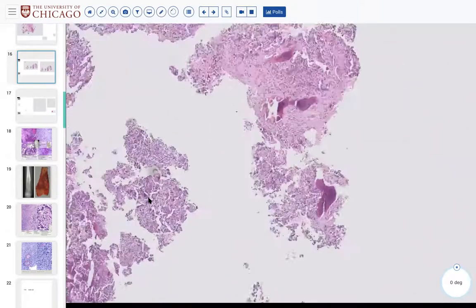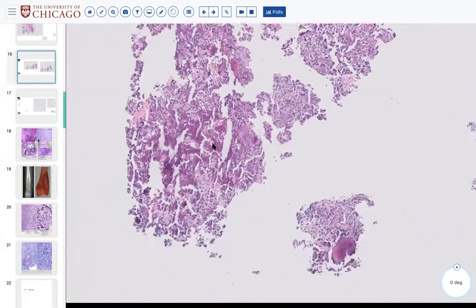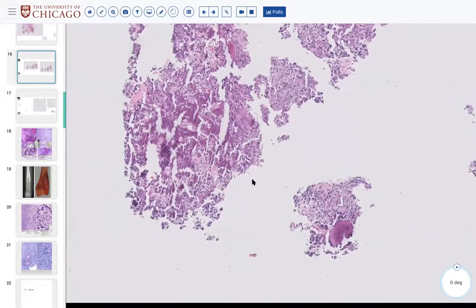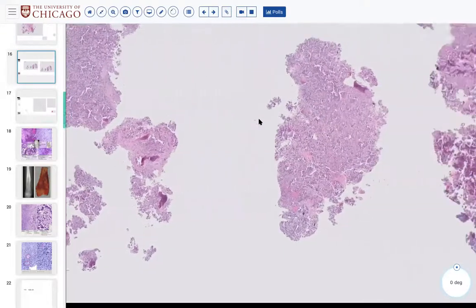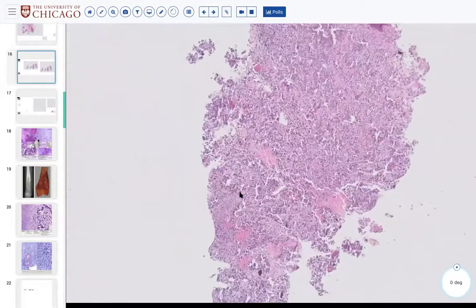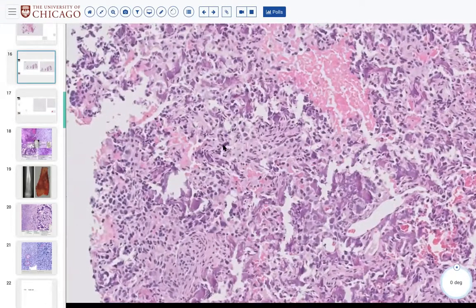And so, you know, when we talk about, you'll always hear me say in thyroid, parathyroid, right? Random endocrine atypia, random endocrine atypia. Well, this is not random endocrine atypia. This is not an endocrine lesion, right? So when you see, in a mesenchymal lesion, this random popping out atypia, actually we should be quite concerned.